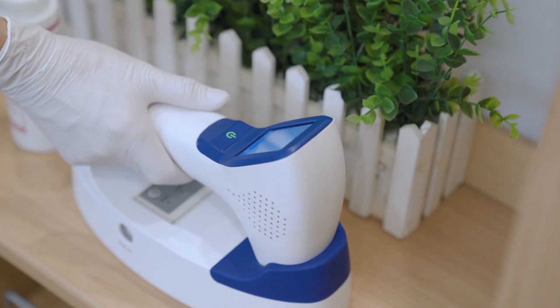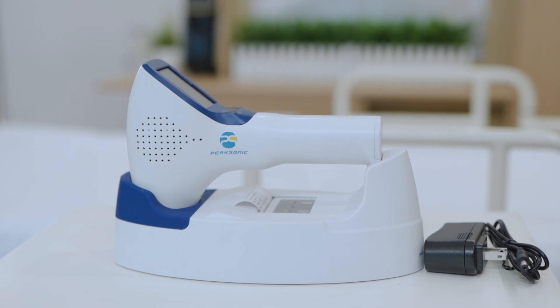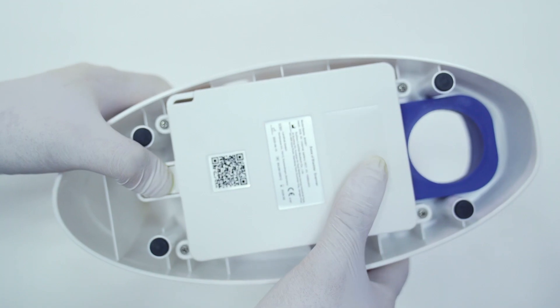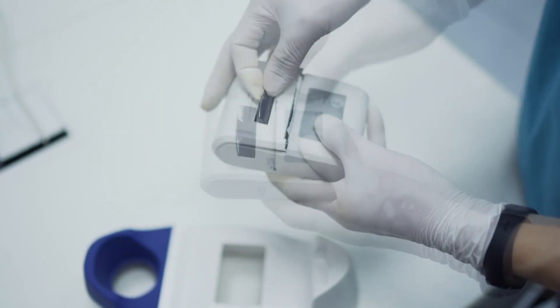When the device is not used, place the probe on the docking station where the Bluetooth printer is embedded. The printer can be removed by pressing the button and sliding the retaining cover away.